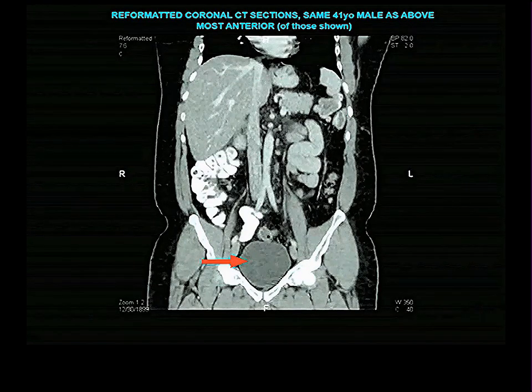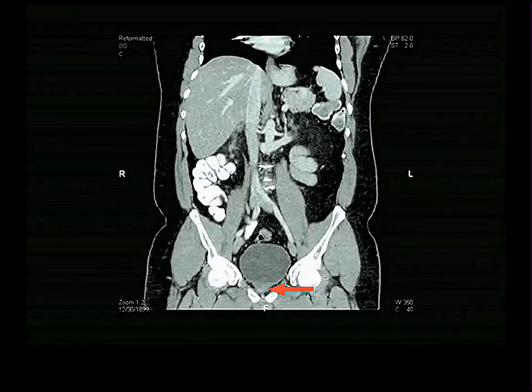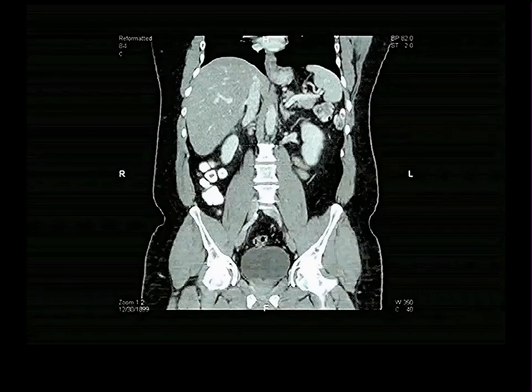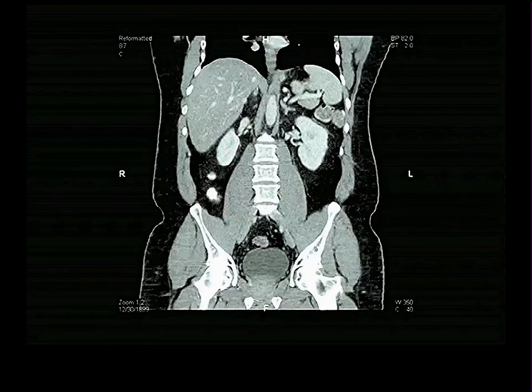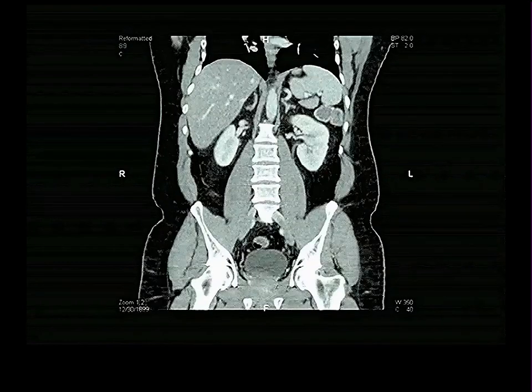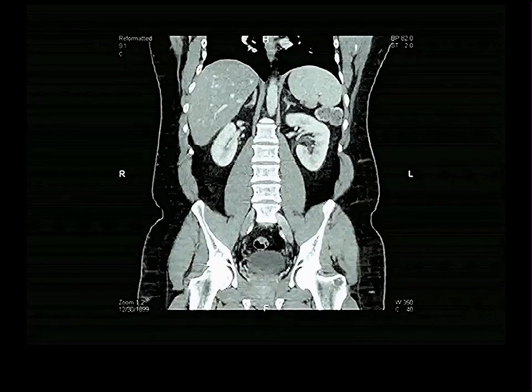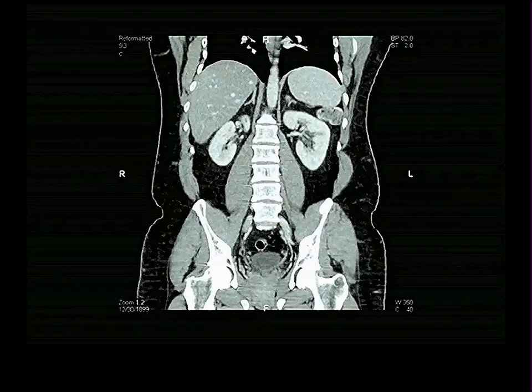Male. Bladder, if we go backwards, we expect to see prostate eventually coming into view underneath the bladder. And here it is. That must be the prostate right there. What else could it be on the undersurface of the bladder? We continue going backwards. Still we see prostate and bladder. Continue going backwards. These could be ureters, but I'm not certain. I doubt it. I don't know what they are. We go backwards further. Bladder is getting smaller and smaller.